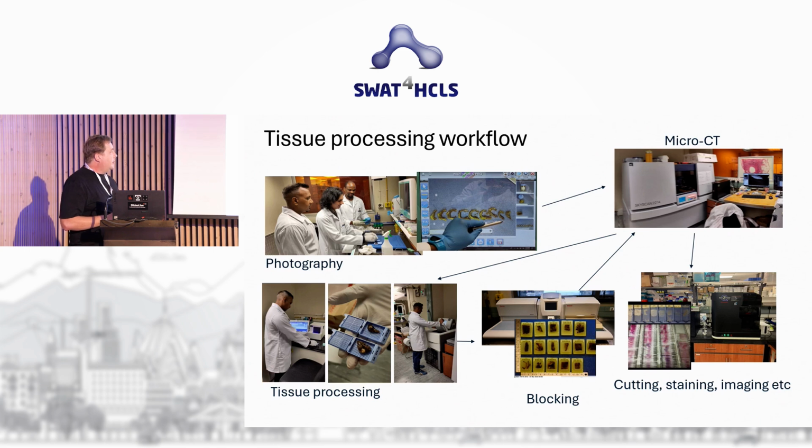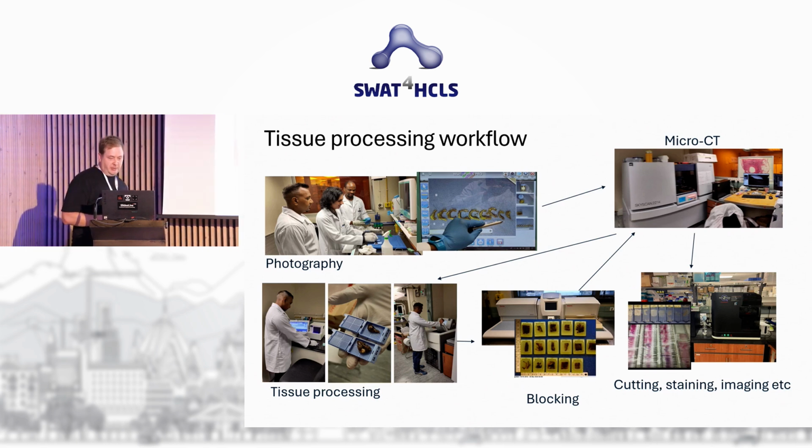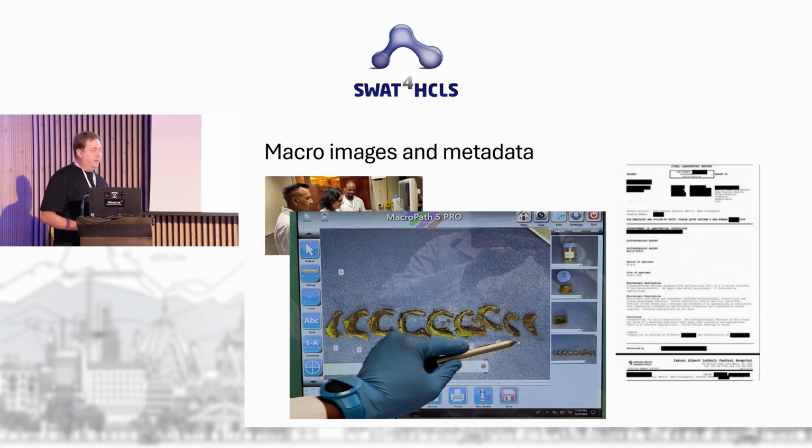But then from a single sample, we can get hundreds of blocks, and from individual blocks, you can potentially get thousands of glass slides, and each of these can be imaged using various modalities. So at each step, there's data and metadata being generated, and there's also potential amplification in the amount of data that is coming out. Now, the way we're capturing our metadata is using REDCap.